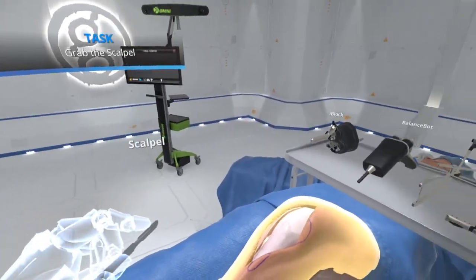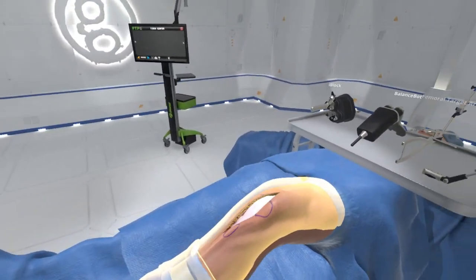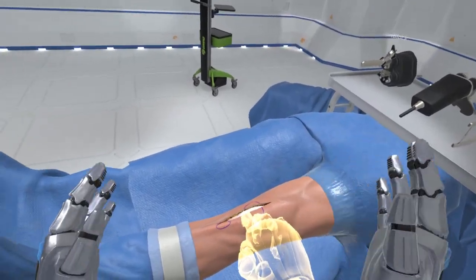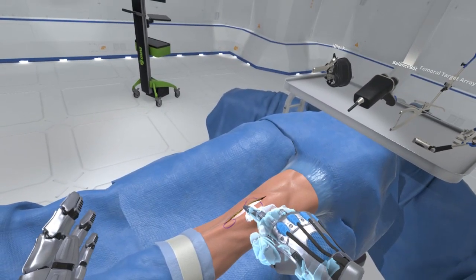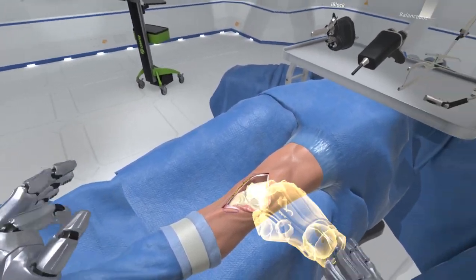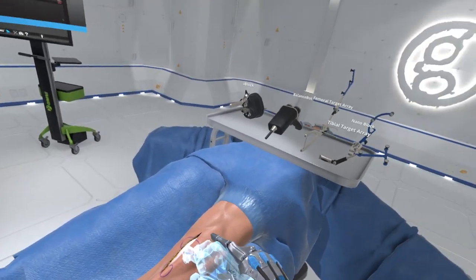Grasp the patient's left ankle, preferably with your left hand. Perfect. Now move the ankle to position the knee. Grasp the lateral margin of the incision, preferably with your right hand. Pull the incision margin laterally, opening the incision. You must grasp and hold the lateral patella dislocation to continue.